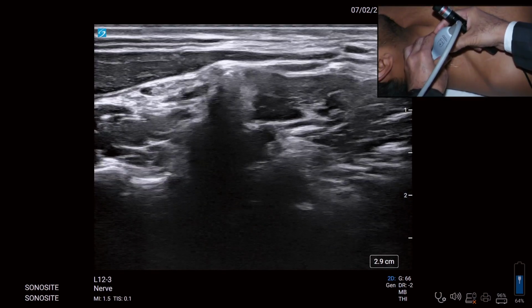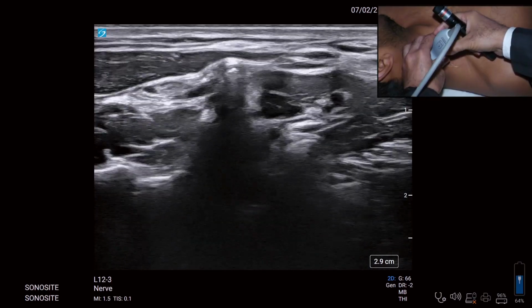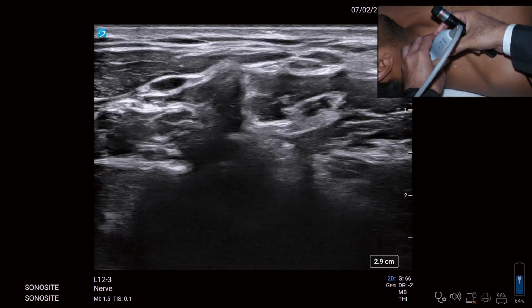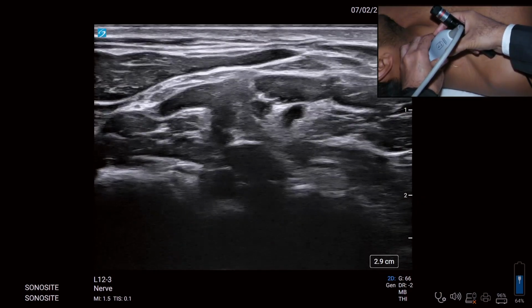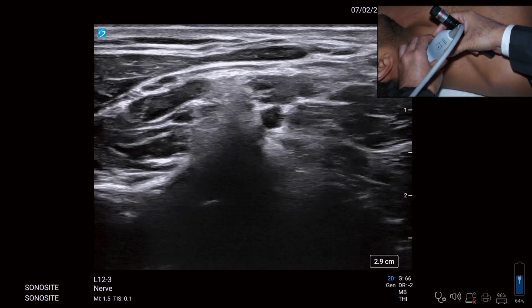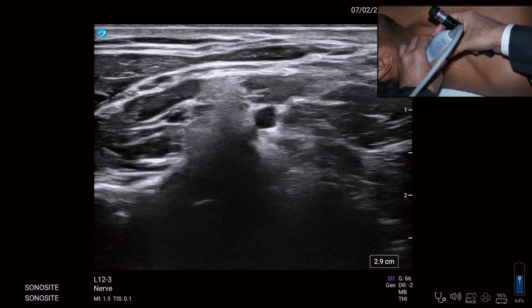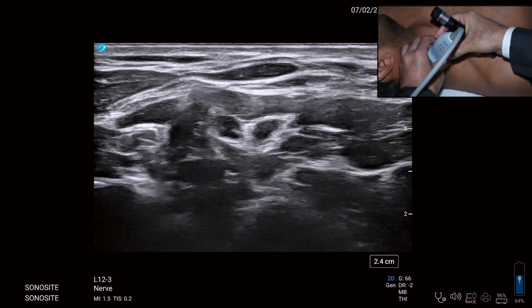can you see the classical C6? Yeah. The C6 dipping into the transverse process of the C6. And this is the Chassaignac's tubercle, the anterior tubercle of the C6. Okay, as I go more up, C5 is diving. Can you appreciate the C5 diving? Yes, sir. So now once I see C5 diving towards its intervertebral foramen, then the job is to go back to the clavicle. So C5 coming out, can everybody appreciate?